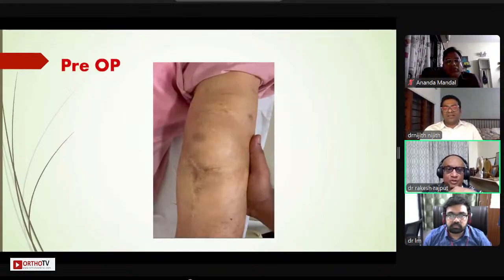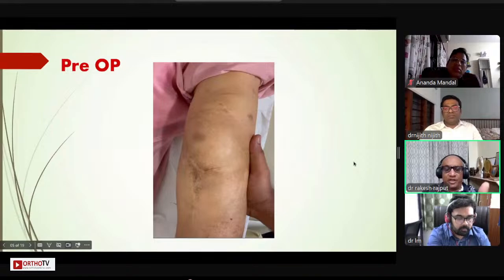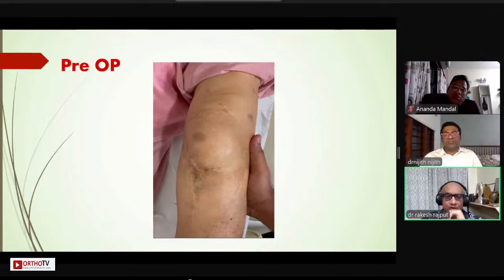So this is the scar I was talking to you about. It is very, very medial, but it's not outside the domain of a TKR. You can still do TKRs from this scar. If you did a UKR, it's very similar to the scar you would actually have. It's a bit more medial than even a UKR, but you can do TKRs even from this scar if you have to use this. So that's your first thing. The transverse scar, which is just below the knee, you can forget about that scar. But you need to get some of your hardware out, which will come into the picture.